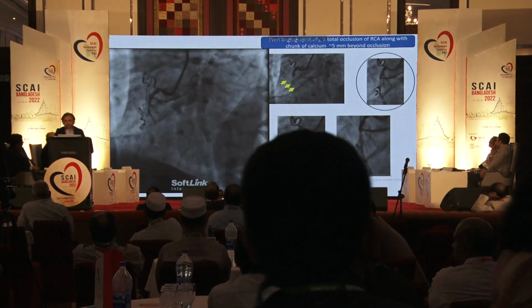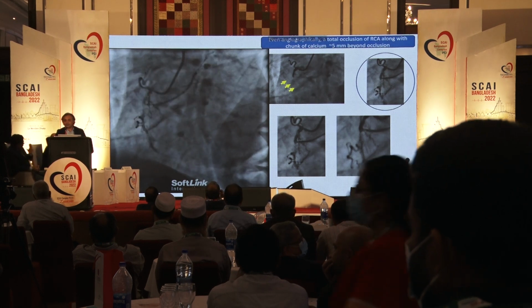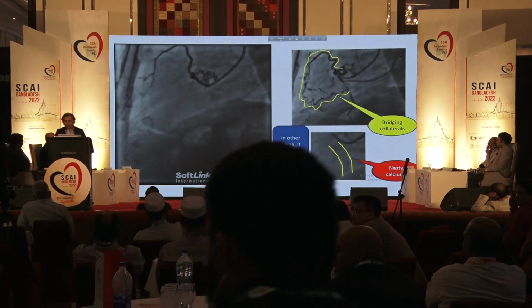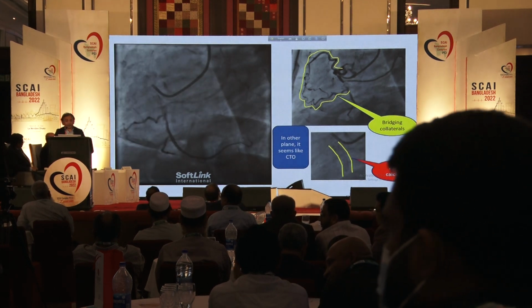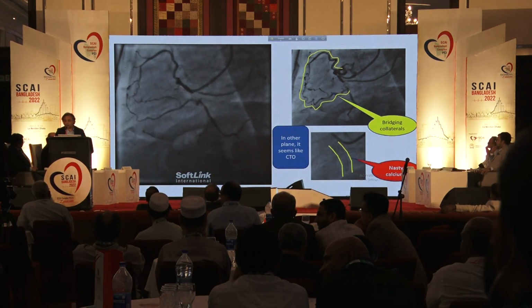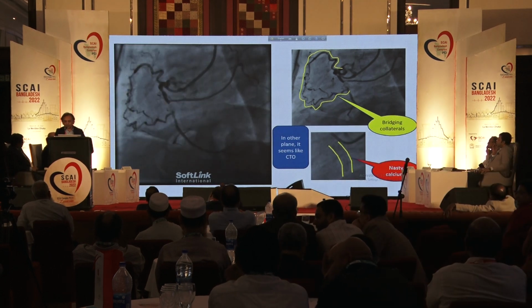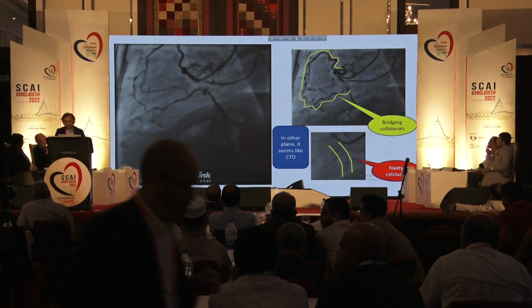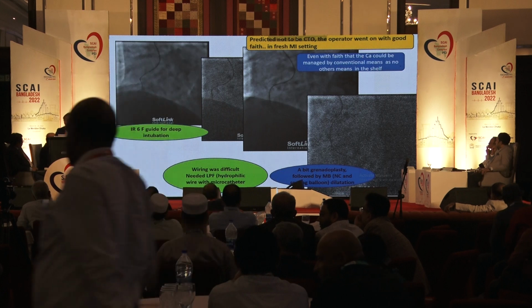And very interestingly, you see the total occlusion of RCA along with a chunk of calcium 5 millimeter beyond the occlusion, which I have shown here. And after that, you see an epicardial collateral is there, which is supplying totally the distal RCA. So how the inferior MI happened, and what actually happened after thrombolysis, we don't know actually, but it's safe to say inferior MI, and it's due to RCA, no doubt about it. And the calcification, you can see angiographically how much is the calcification. So it's quite surprising, and that can be predicted not to be a CTO.